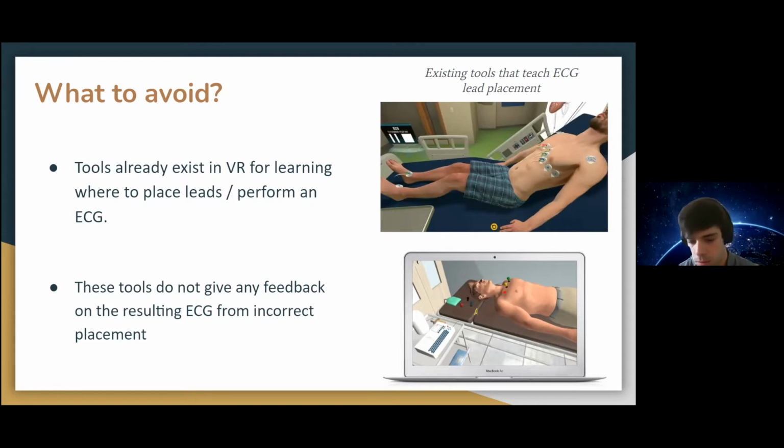And so in the application that we made, we do leave the ability to put the leads anywhere the student wants in order to understand the significance of the placement of each lead. The actual placement of the lead is not necessarily going to be something that a doctor will have to do. Does that answer the question?